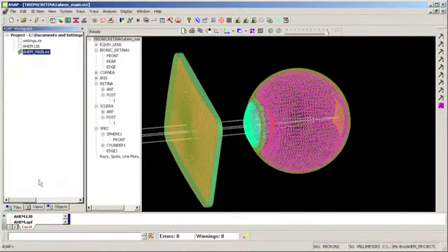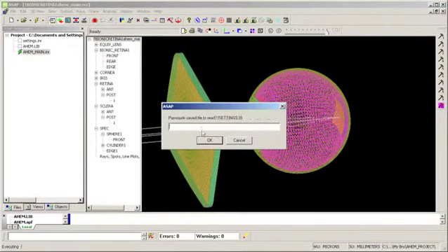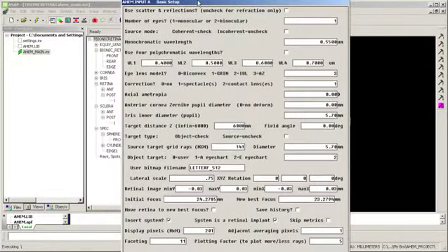So let's go ahead and use AHEM to set this up. I've got my Bionic Retina settings. Alright, so here's my first splash screen, and I've got a basic setup similar to the default model. However, when I get down to the bottom, I have an option to insert system, and a Bionic Retina is a system. But now it asks me, is a system a retinal implant? In this case it is, so I have that checked.